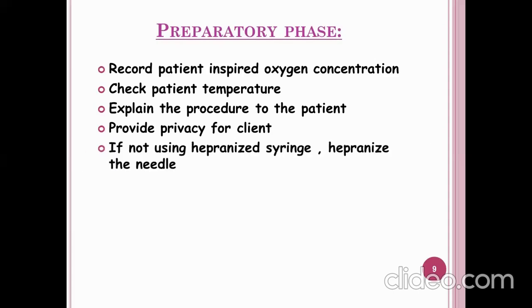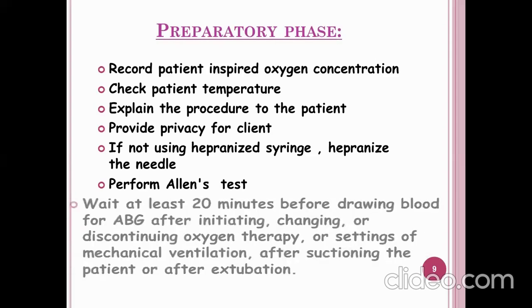If not using a heparinized syringe, a heparinized needle must be used. If we are not going to use the heparinized syringe, then we must use a heparinized needle. As you all know, heparin is a natural anticoagulant. Perform Allen's test, I'll explain in another slide. So we have to perform the Allen test.